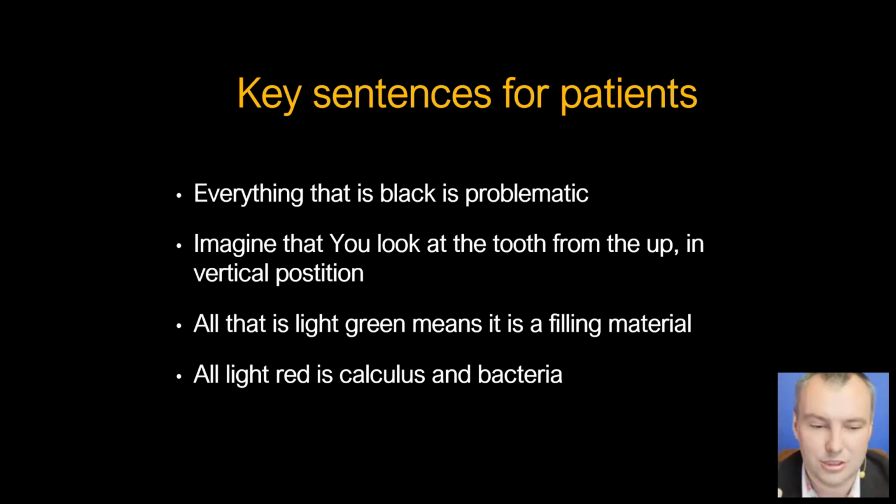For the fluorescence mode, all that is light green means it's filling material, because most of the composites have some fluorescence. All that is light red is calculus and bacteria in fluorescence. We'll see it in a moment as well.